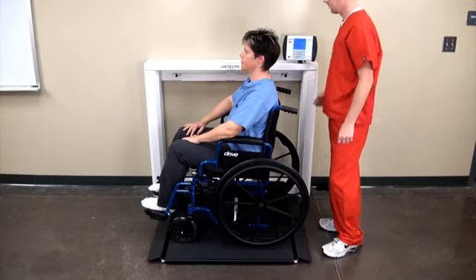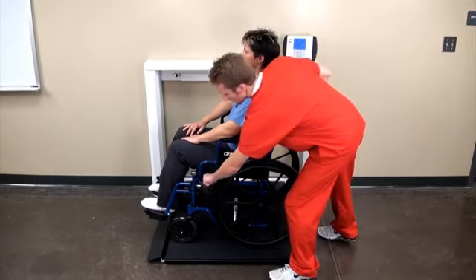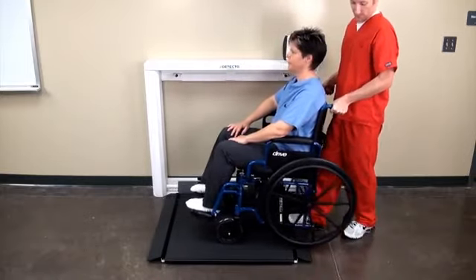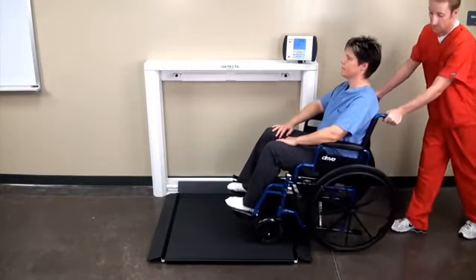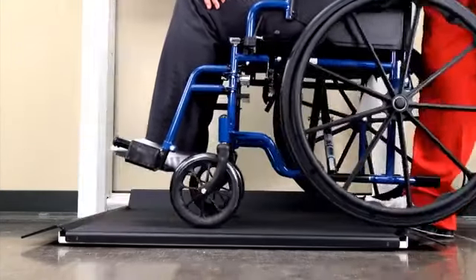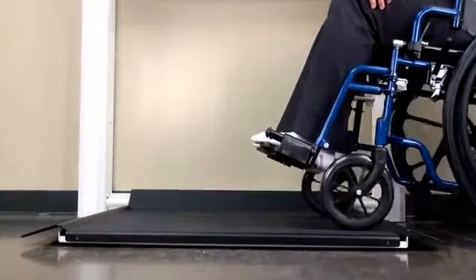When the patient has been weighed, they may be rolled off the scale. The 1.5-inch, 38-millimeter high platform is very low to the ground for patient access, making the process easy and requiring minimal effort to roll the patient on and off the weighing platform.